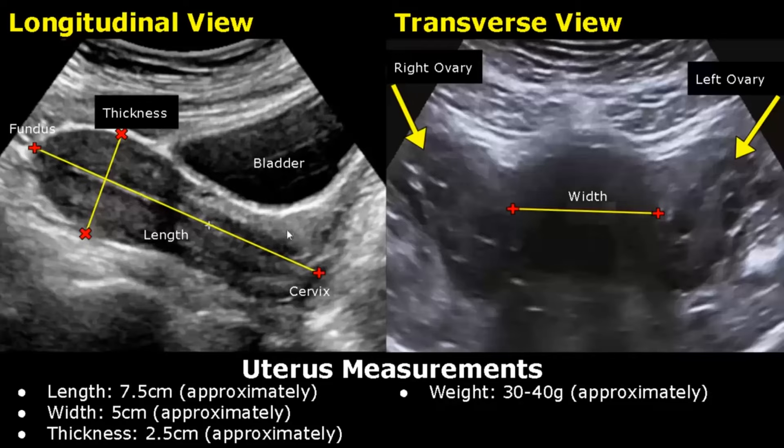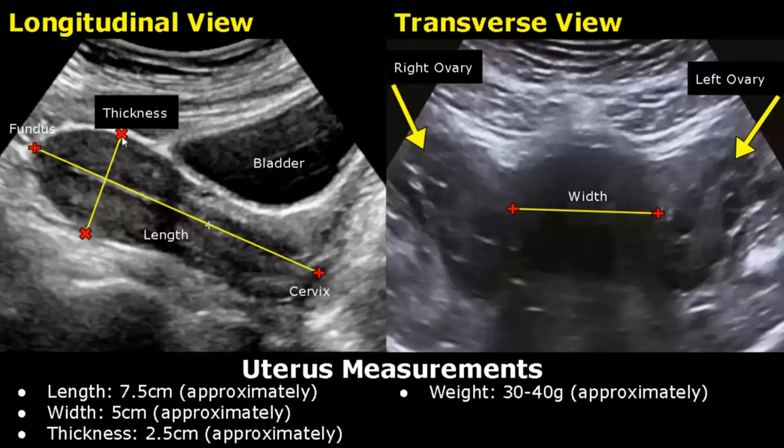In the longitudinal view, we can measure the length and the AP thickness of the uterus. One caliper is placed at the top of the fundus and the other caliper is placed at the base of the cervix. The length of the uterus is around 7.5 cm approximately, and the thickness is around 2.5 cm.